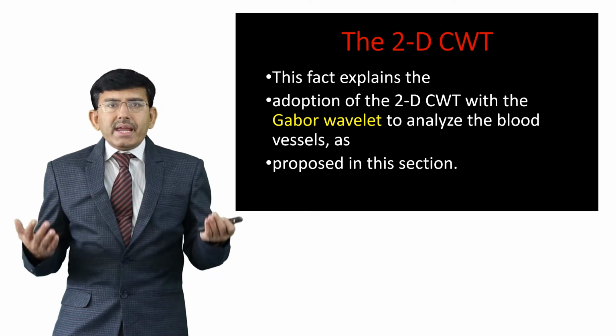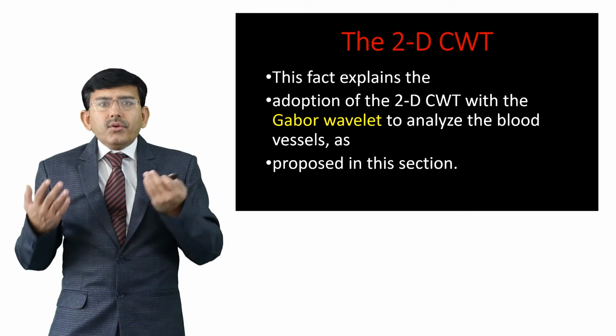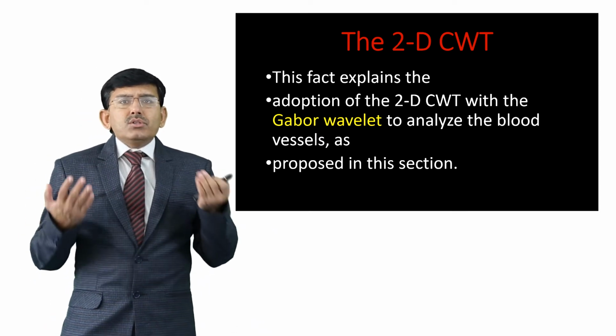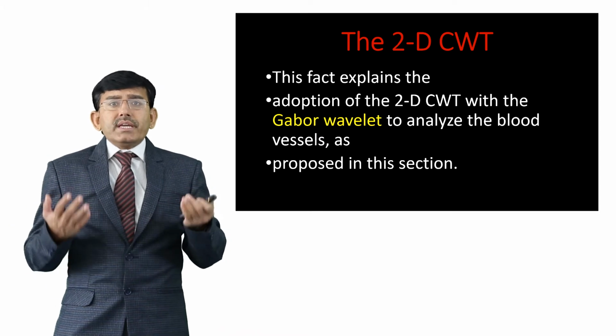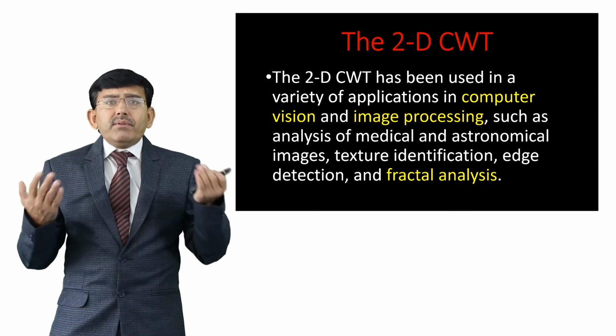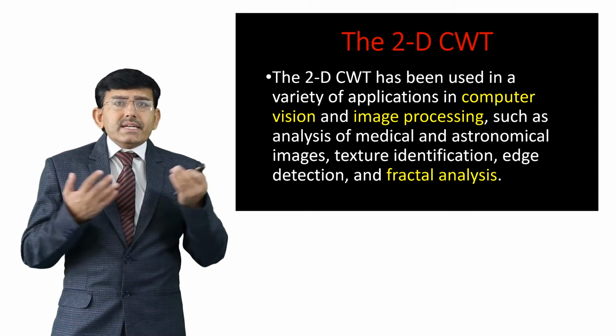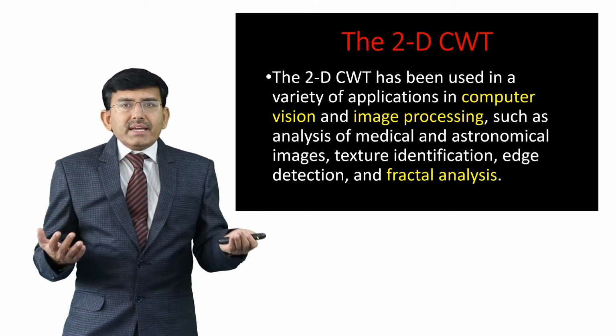This fact explains the adoption of the 2D CWT with the Gabor wavelet to analyze the blood vessels as proposed in this particular module.